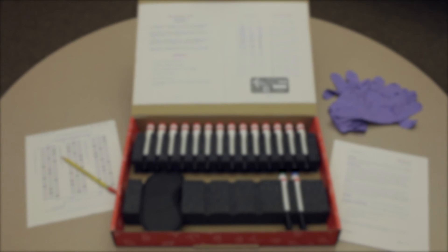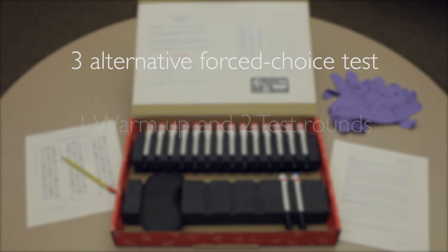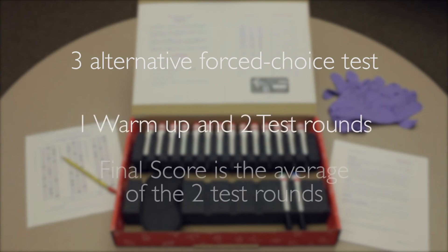The odor sensitivity test kit is a three-alternative forced choice test to estimate an individual's threshold to the test odorant n-butanol. The test procedure involves presenting two test rounds after a warm-up series. The final result is the average of the two rounds of testing. We recommend that first-time users be tested three times to establish a baseline. Also, individuals should be retested periodically to monitor their sensitivity.